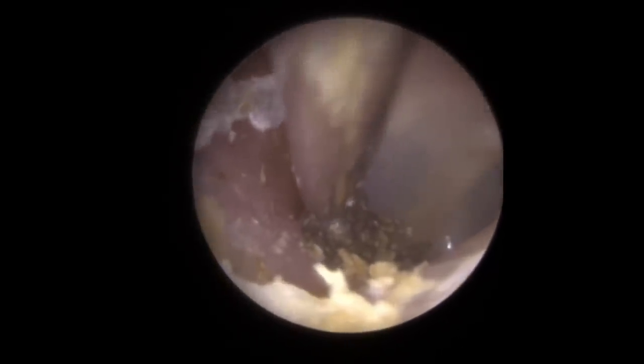We've got these harder wax pieces — you can see how well attached that is to the canal wall. There's also a ring of dry skin in there. The difficulty, especially with this type of dry skin — and I know from past experience with this patient — if we start peeling this, the skin is so dry it does tend to just tear almost the top layer of skin, so you do sometimes get a little bit of bleeding. I've elected to leave most of these little flakes of dry skin because it runs the risk of infection, and obviously with the current climate, people aren't able to get to their GPs as easily. So we decided we'd leave a lot of this dry skin for this time.